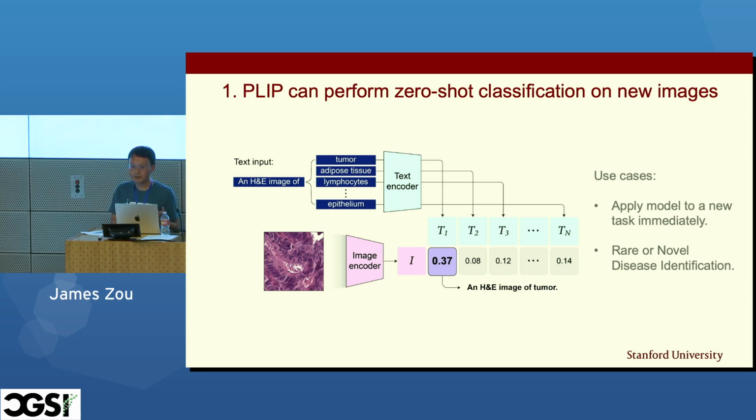The benefit of doing this is that the Twitter data is actually very heterogeneous. There are lots of rare diseases that are discussed on Twitter. People typically talk about shared images that are harder for them to diagnose, or less common images. So this kind of zero-shot performance can help us diagnose new or less common diseases.